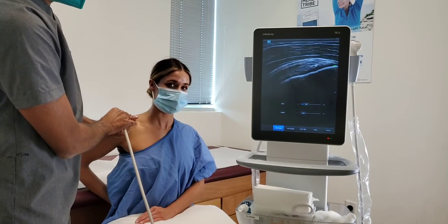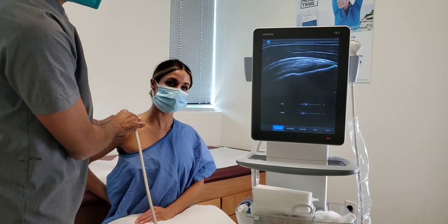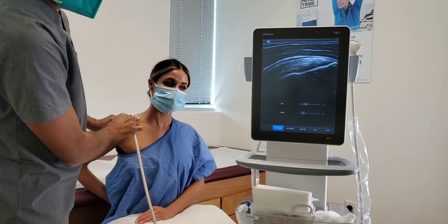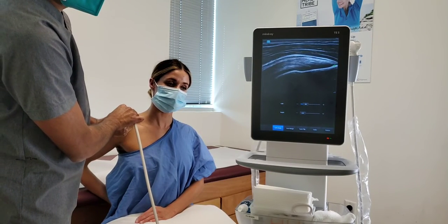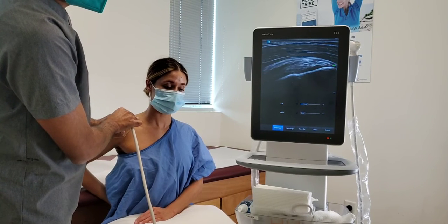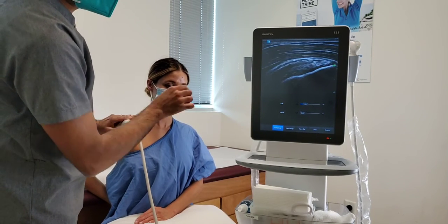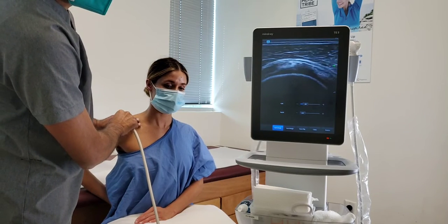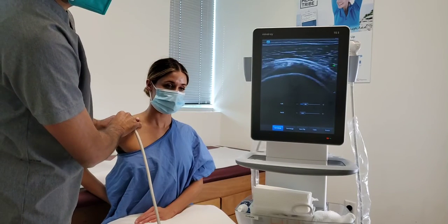So I look at the supraspinatus tendon and I go through from multiple different areas here, trying to see if there's any kind of tearing or tendinopathy or bursitis. And again, there is a little bit of schmutzy stuff inside the tendon here. So there is a chance that there is a little bit of irritation to the tendon going on.